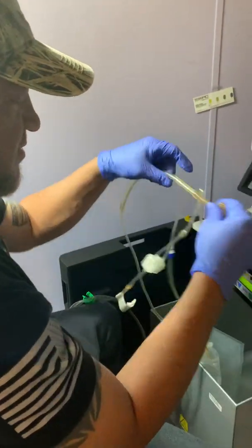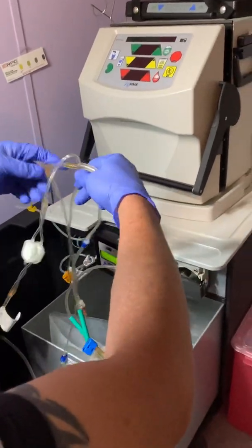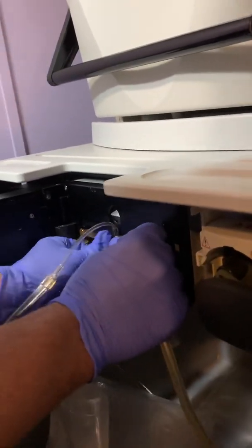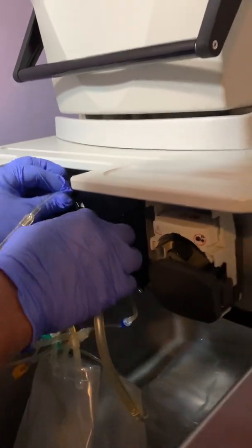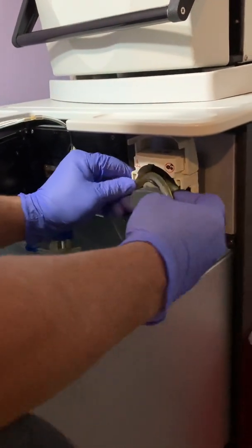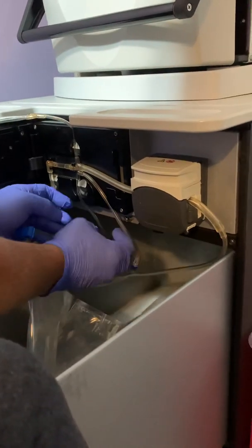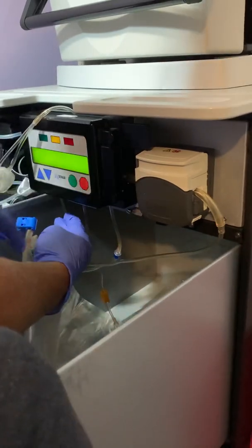Then you take this little conjunction piece right here where they're all kind of together, and you load it in here with these little clips. With the thick line leading towards your other door — the thick line going to the right because that's going to go through this little thing right here. Then you close this. Then all these lines you gotta make sure they're going down so they don't get pinched. Then you close your door like it tells you to.